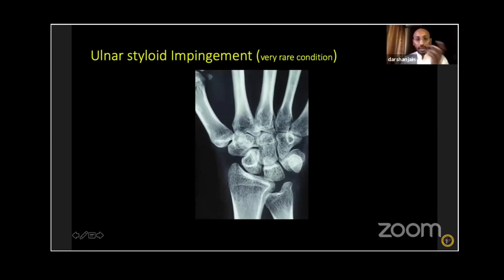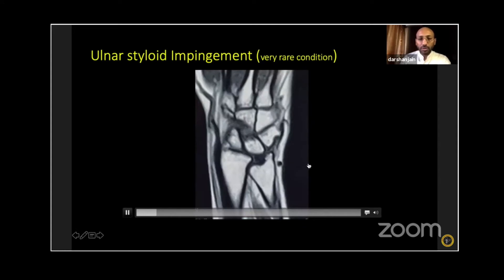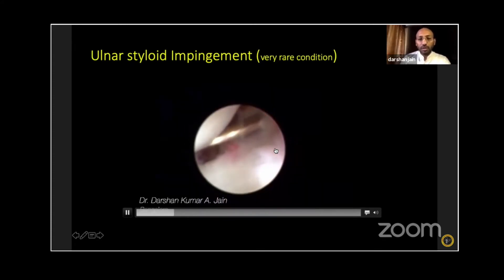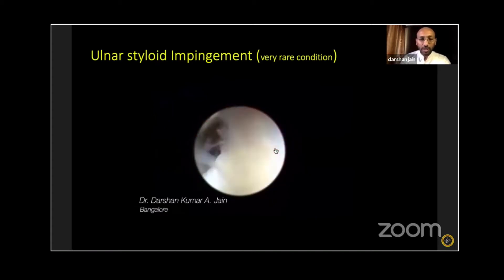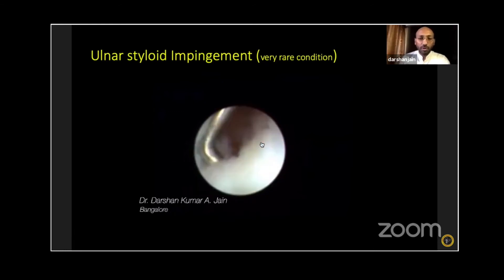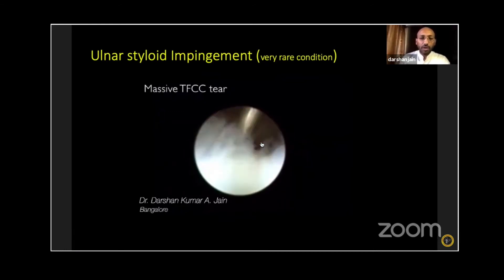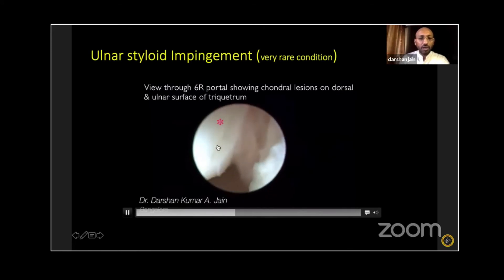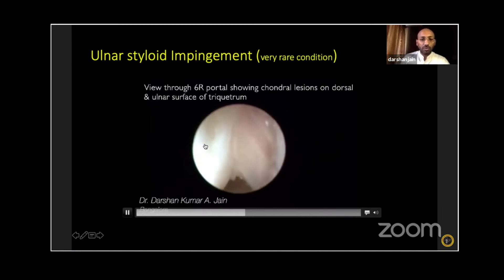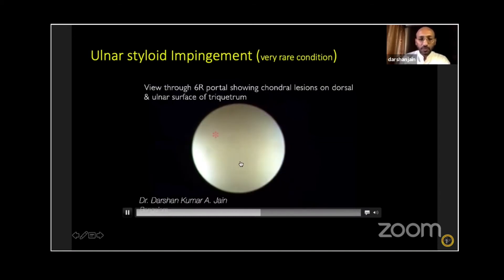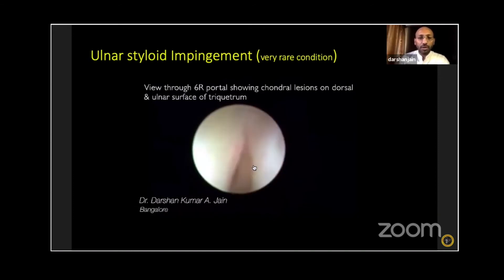This is a rare entity called ulnar styloid impingement. Even with negative ulnar variance, there is a prominent ulnar styloid. MRI shows indentation on the triquetrum with multiple cystic lesions from repeated injury over more than two years. Arthroscopic visualization revealed a massive irreparable tear, plus significant chondral lesions on the triquetrum and lunate. Arthroscopic drilling can be performed to stimulate fibrocartilage formation. In this situation, you could also remove the prominent ulnar styloid arthroscopically.